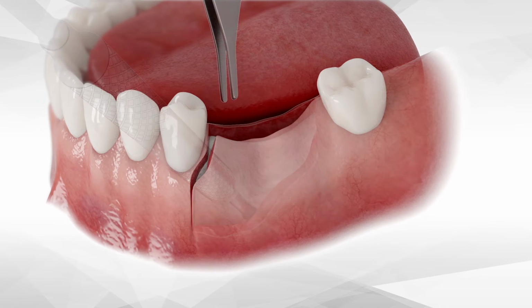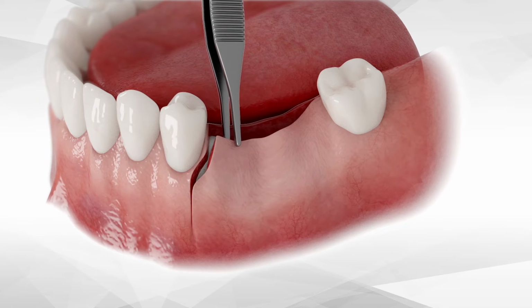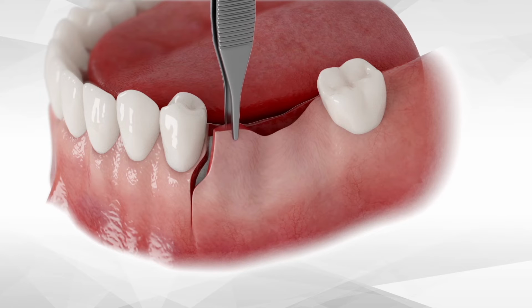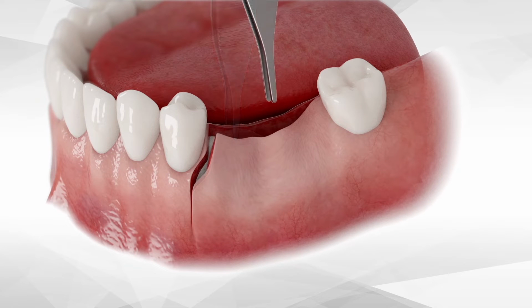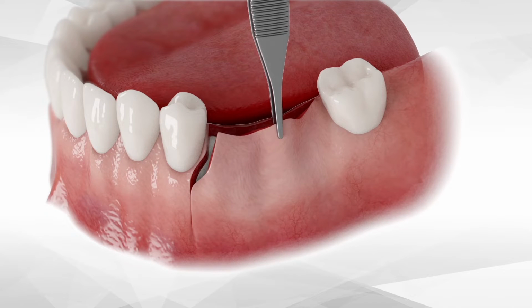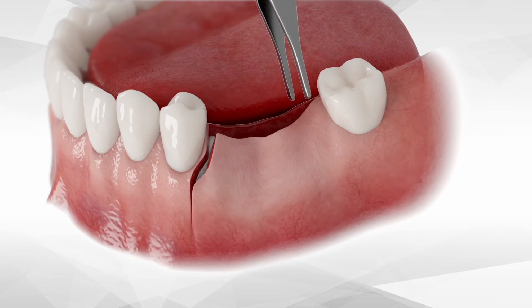Once flap elevation is complete, grasp the mesial corner of the flap and stretch, then the middle part of the flap and stretch, followed by the distal part of the flap and stretch. Reflecting 3 millimeters into the mobile mucosa will enable the flap to be stretched at least 6 millimeters.